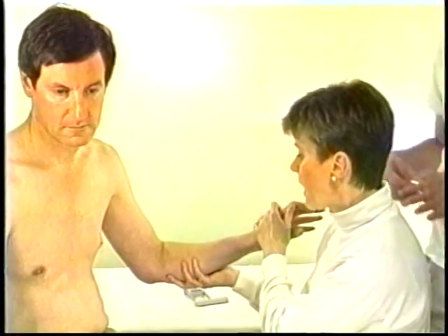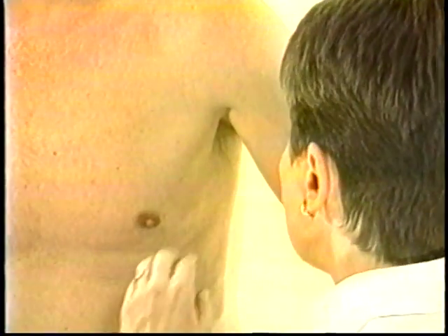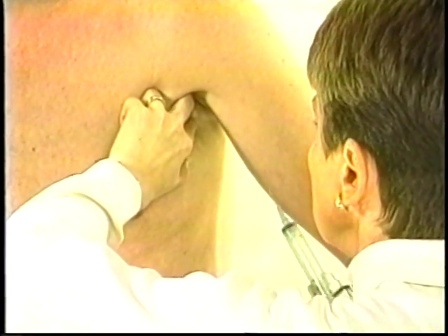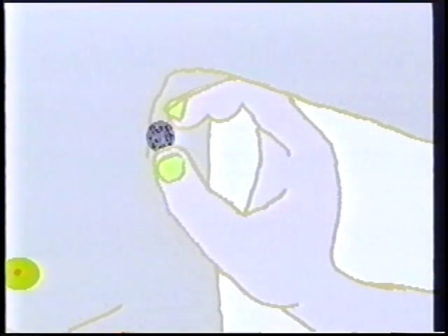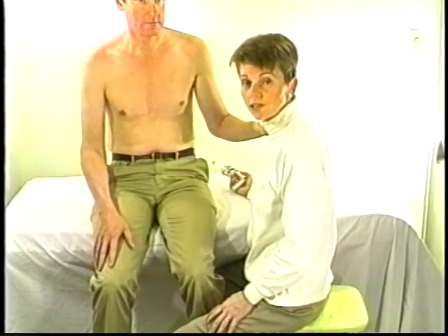Another possibility is to have an assistant support the patient's arm in the same position. With the patient in this position, it is possible to reach and sample most masses in the axilla. The mass is localized and then trapped against the chest wall with the fore and middle fingers. The thumb of the same hand is used to stretch and flatten the skin below the target to ease access for the needle. Access is made easier by having the operator sitting at a slightly lower level than the patient.